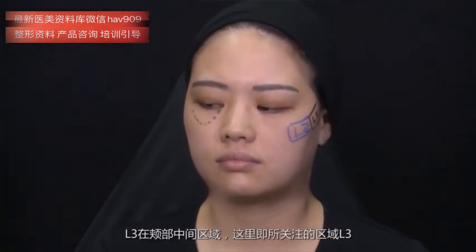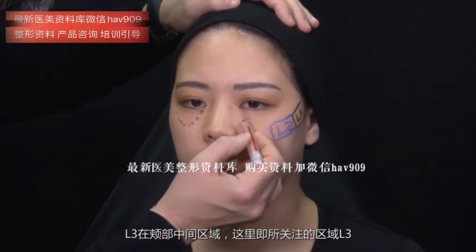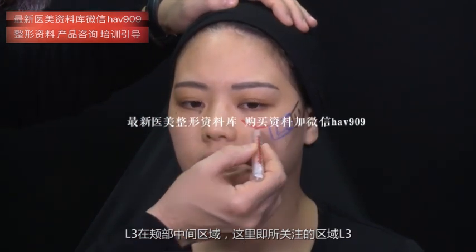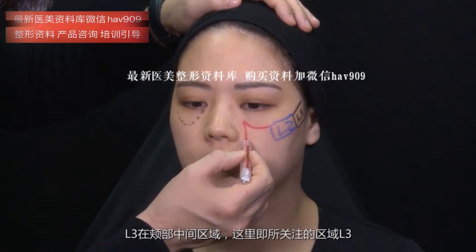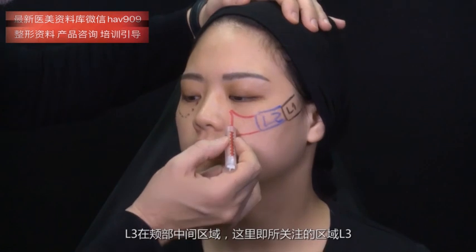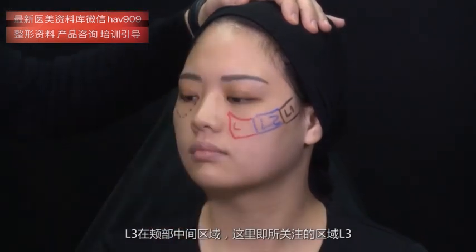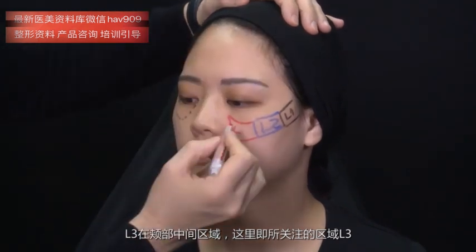L3 is the mid-cheek area, and this is the area of concern. So we have here L3.